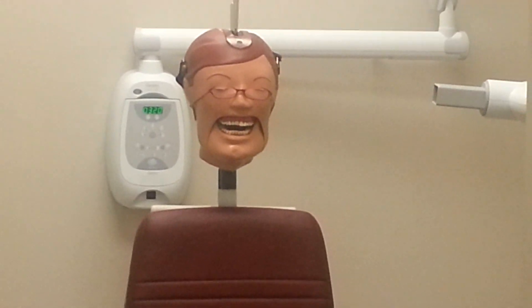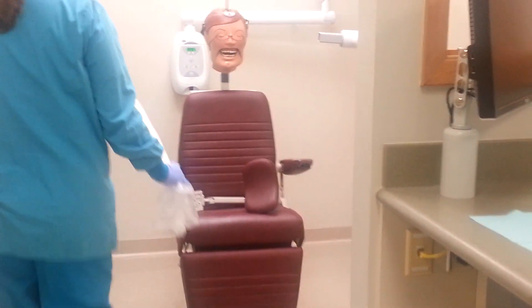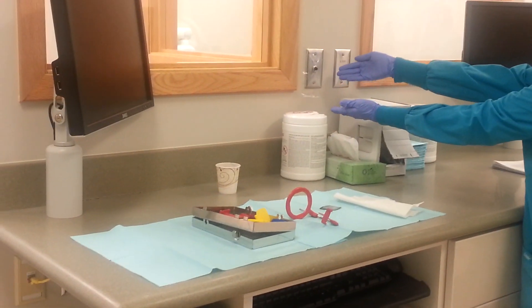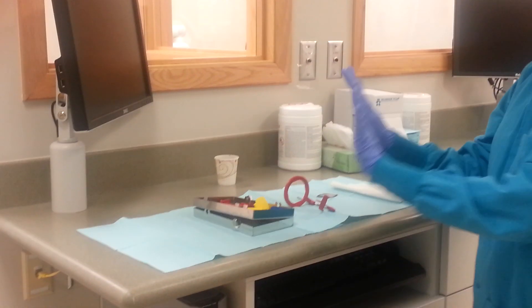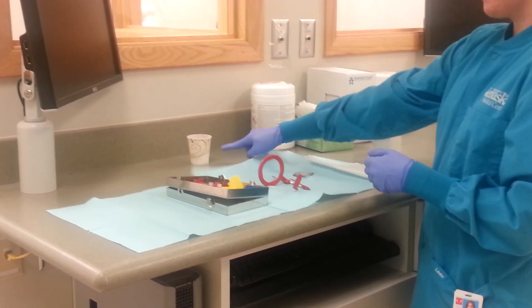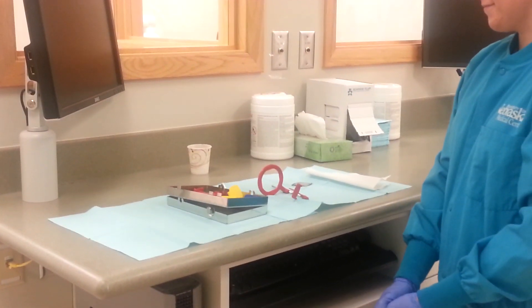Begin any radiograph procedure by properly setting up your unit and gathering your supplies. Place a plastic bag over the patient chair and cover the exposure switch with barrier tape. Then lay out a blue patient napkin to arrange all your needed supplies and cassette. Gloves should be worn when handling phosphor plates and instruments that have been in contact with the patient, but do not touch the cup used to carry the phosphor plates. This cup should be kept off the blue napkin to avoid contamination, so it may be used to carry the plates to be developed.